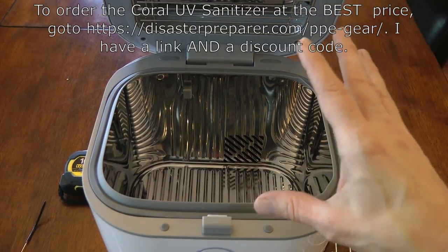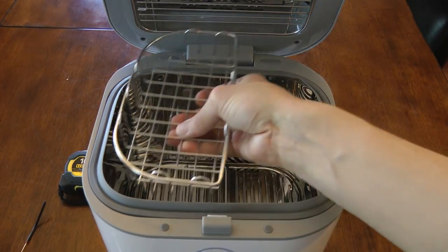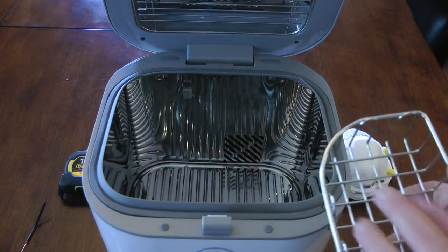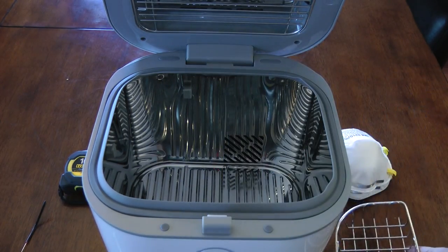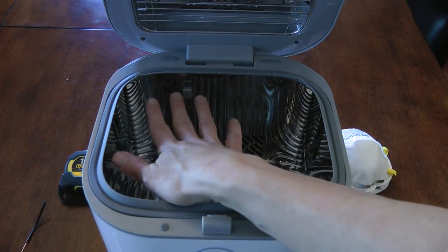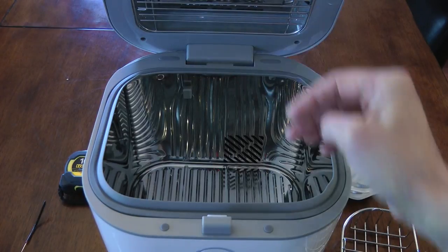The Coral Sanitizer comes with small plastic hooks in it, which are used to support the basket. The basket goes in one corner and you could put small items on it, like a cell phone or keys. That works great because it keeps those items very close to the top of the chamber, where the two bulbs are.